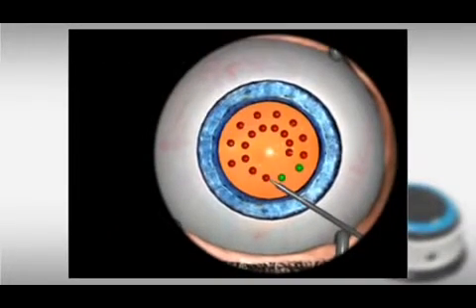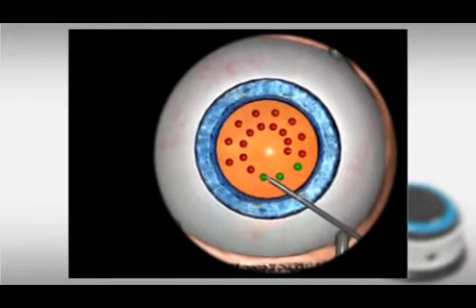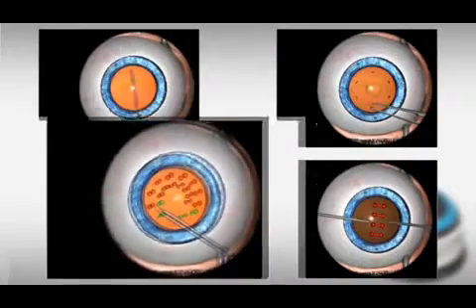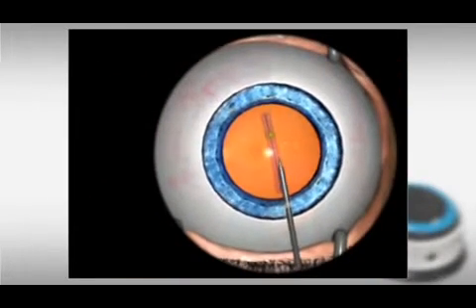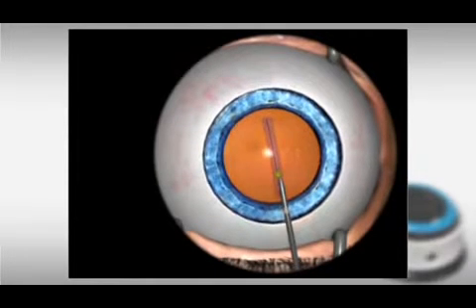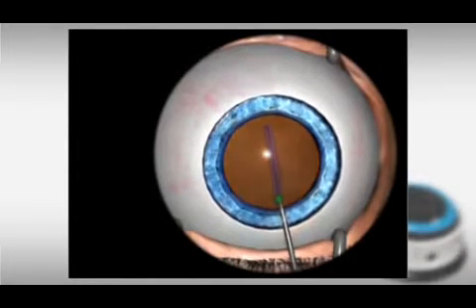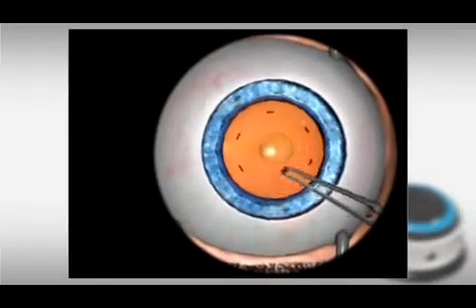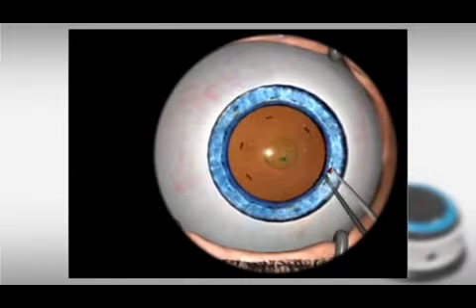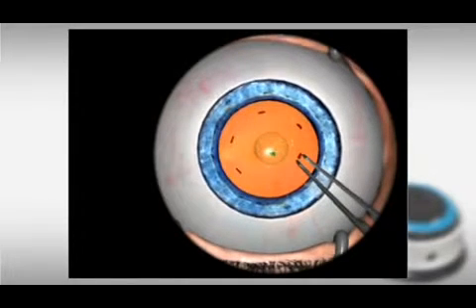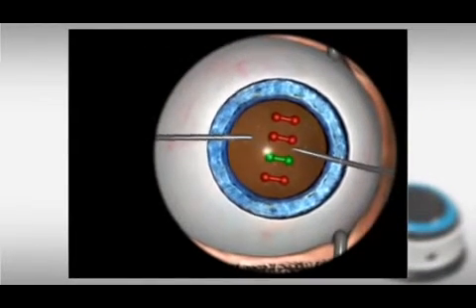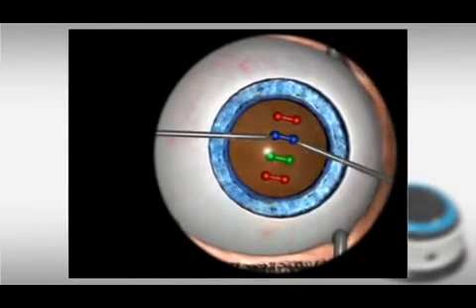In this level, the red dots within the anterior chamber have to be touched. In the second task, a dot has to be moved without tremor. Grabbing three-dimensional figures with a forceps can be difficult. Please note the movements within the eye. In the final example, bimanual instrument handling is trained.